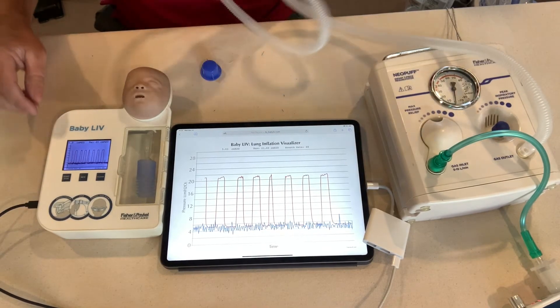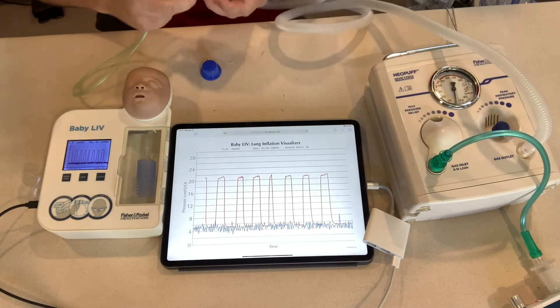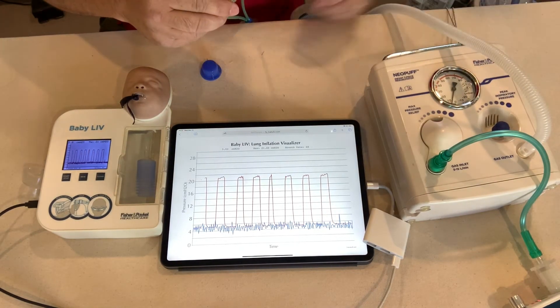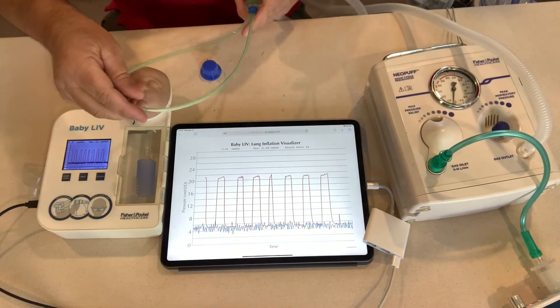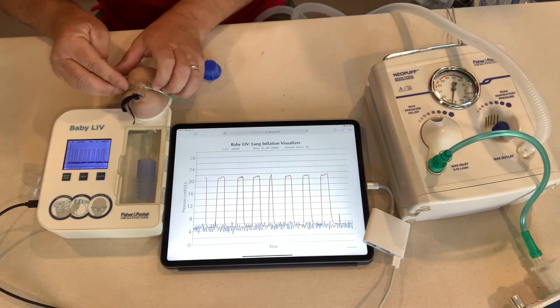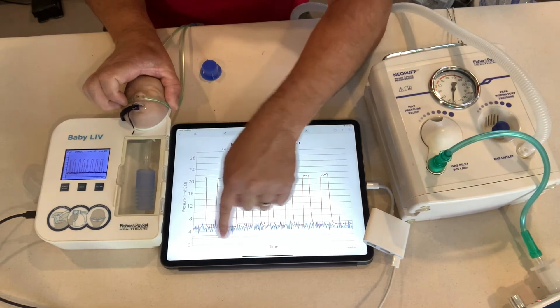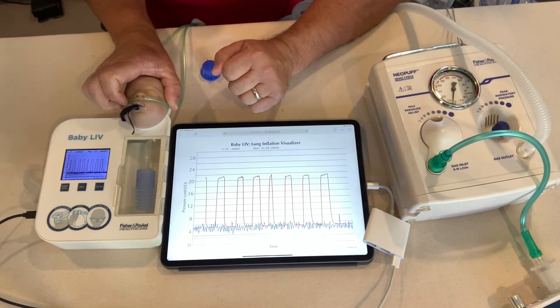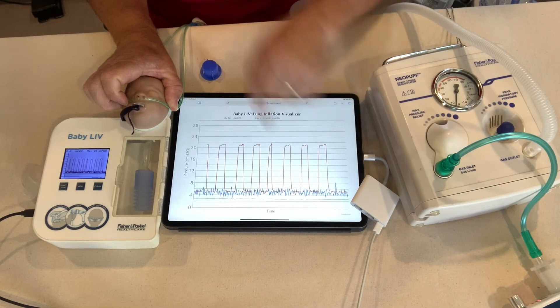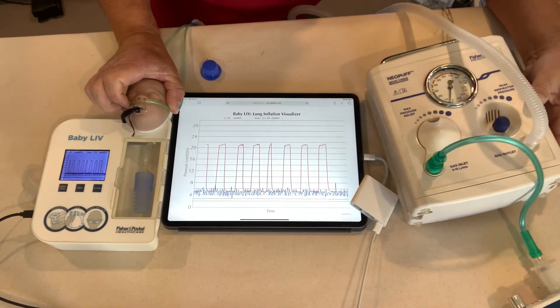Now we're going to move over to the RAM cannula. I've chosen one that is 100% occlusion, because that was my argument this morning. We're going to make sure we get a 20 over 5 with the RAM cannula. I have it occluded, everything looks good. I'm going to hold that in place on the baby's nose — creating a new reading — and if you look down here, my PEEP is 3. There is a PEEP of 3 on the green line, which is not matching my Neopuff — my Neopuff is still reading 5.